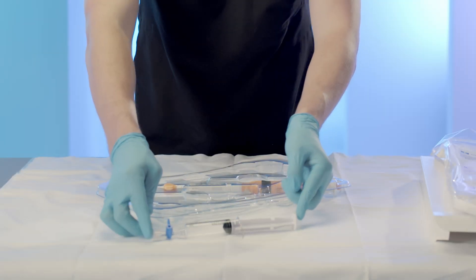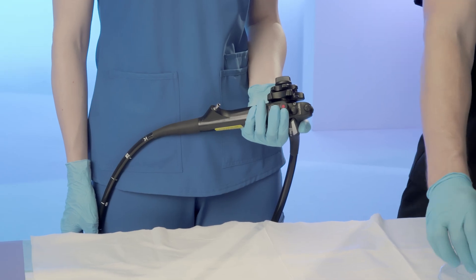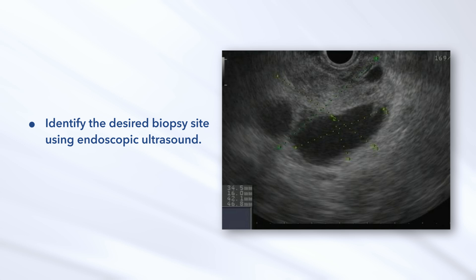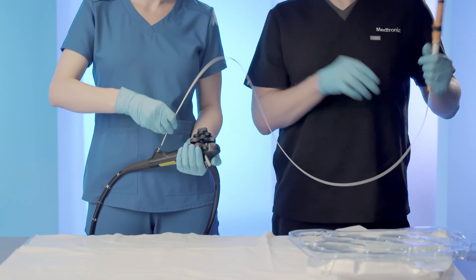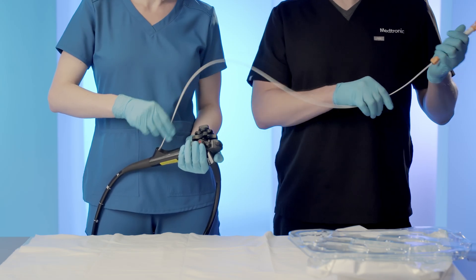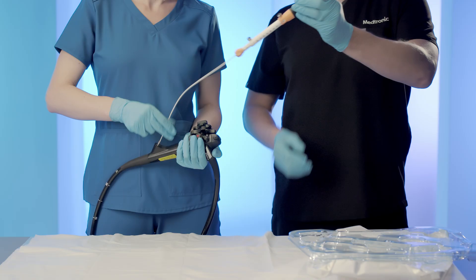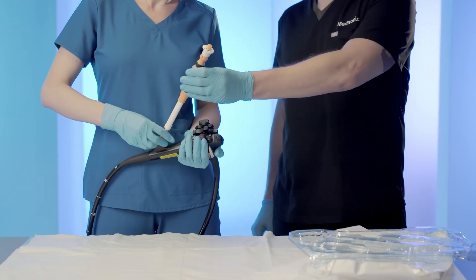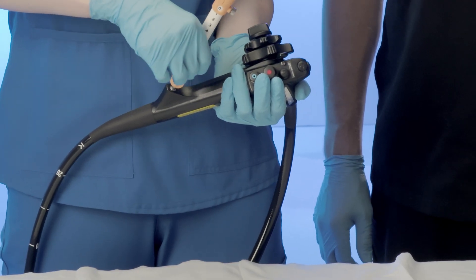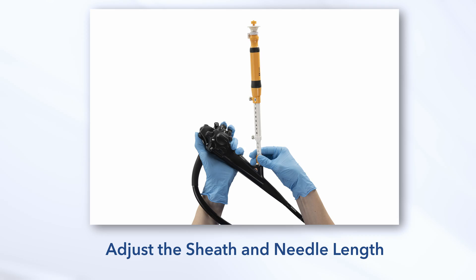Set the prepared syringe aside until needed for aspiration biopsy. Insert the device into the endoscope. Identify the desired biopsy site using endoscopic ultrasound. Insert the device into the ultrasound endoscope in short increments until the luer lock fitting at the base of the sliding sheath adjuster meets the fitting on the instrument channel. Attach the device to the instrument channel port of the endoscope by rotating the device handle until the fittings are securely connected.